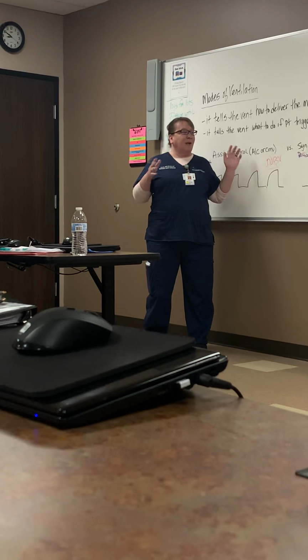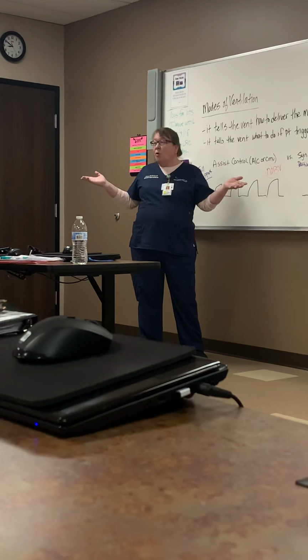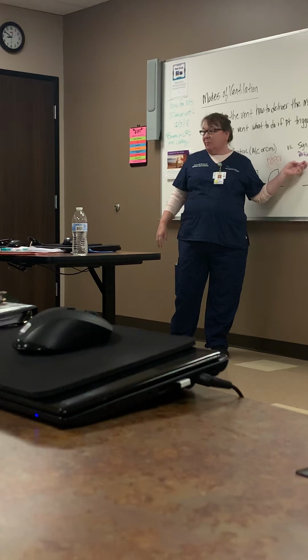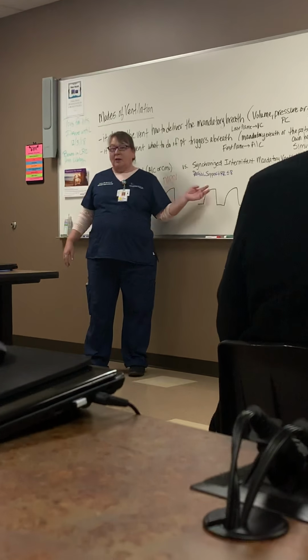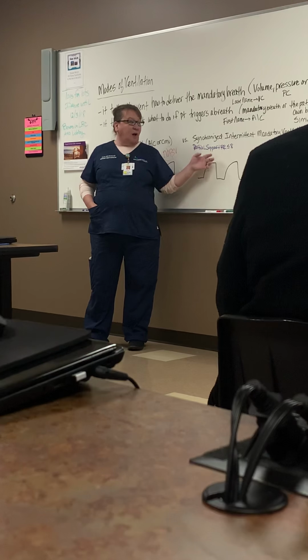Yeah, so I'll talk about this now because it always comes up. Technically, in the old world, and what seems like would make sense to you guys, we would go from AC, full support, then over here to partial support, and then work to take my patient off the vent. The problem is, SIMV is really not a good mode. It's still used in some places, but a lot of places are not using it at all.